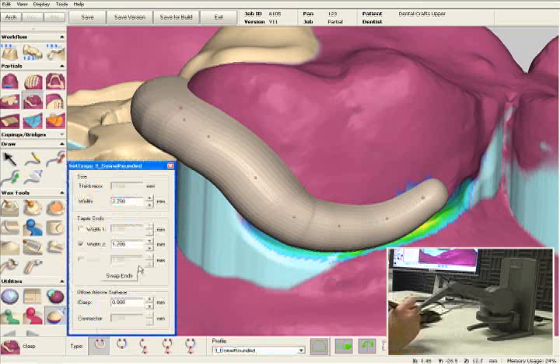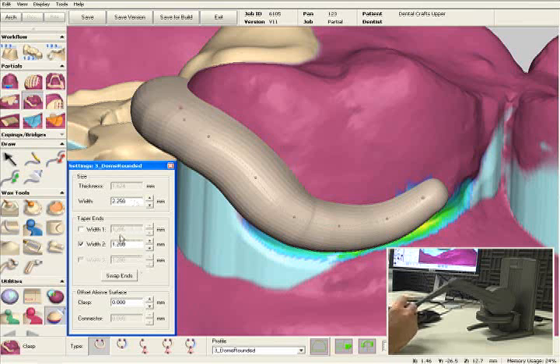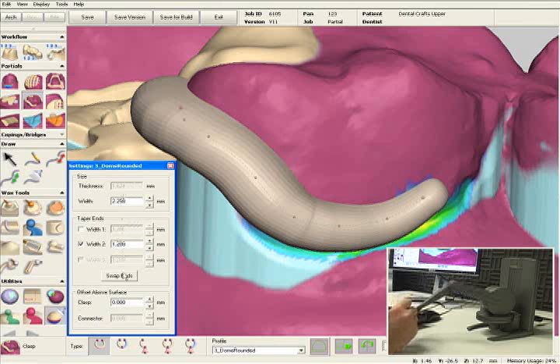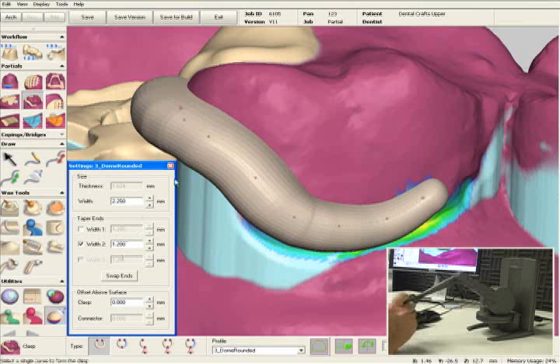All of these settings can be preset ahead of time so you don't have to change them from case to case. But if you did need to change them on any particular case, the settings are right here, so you have the option of modifying the thickness, the width, taper ends — anything you want.